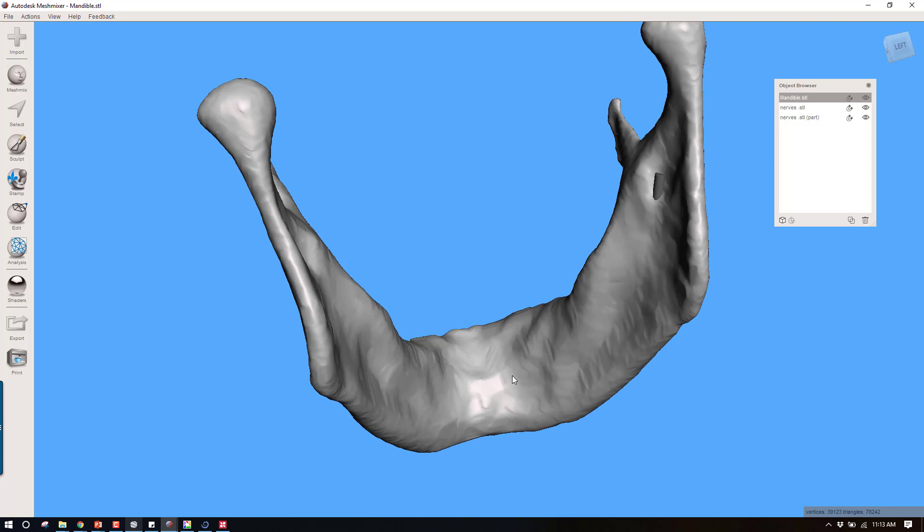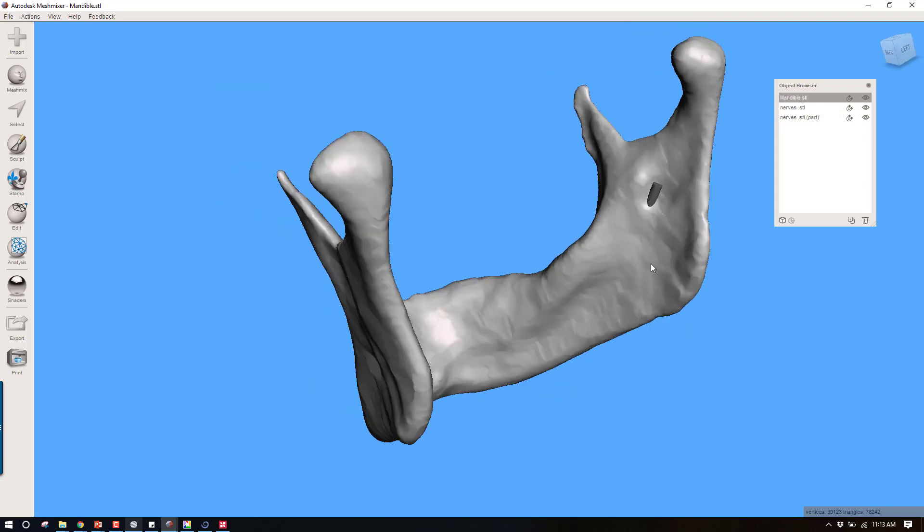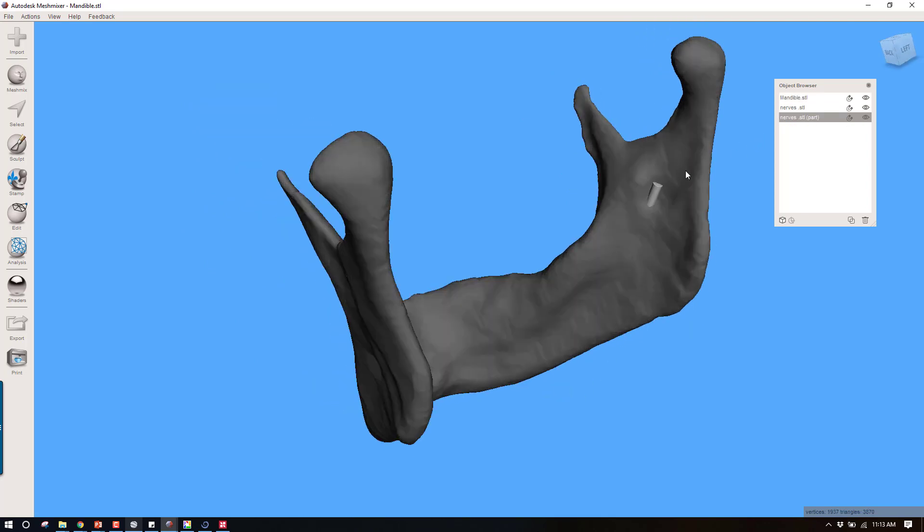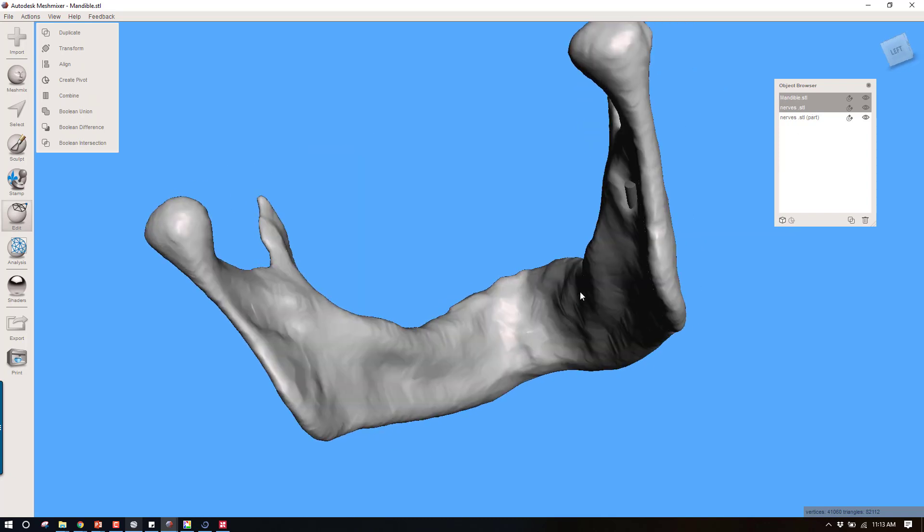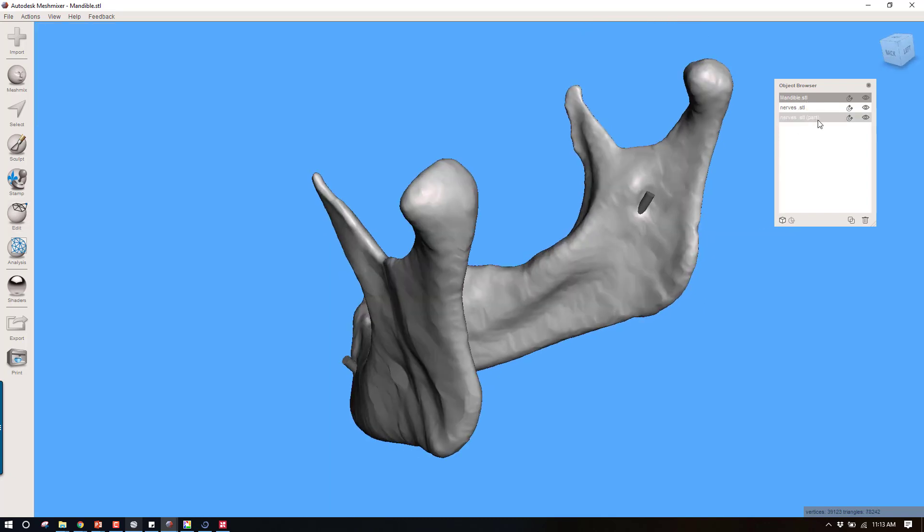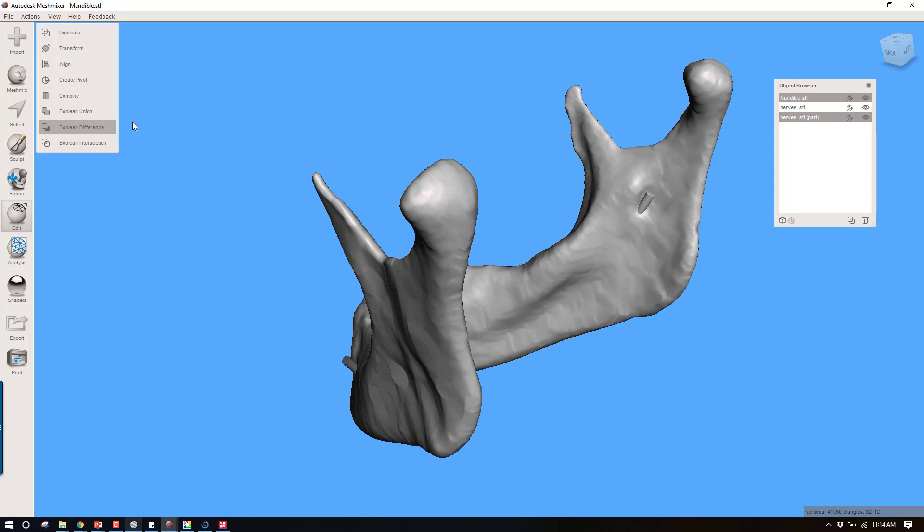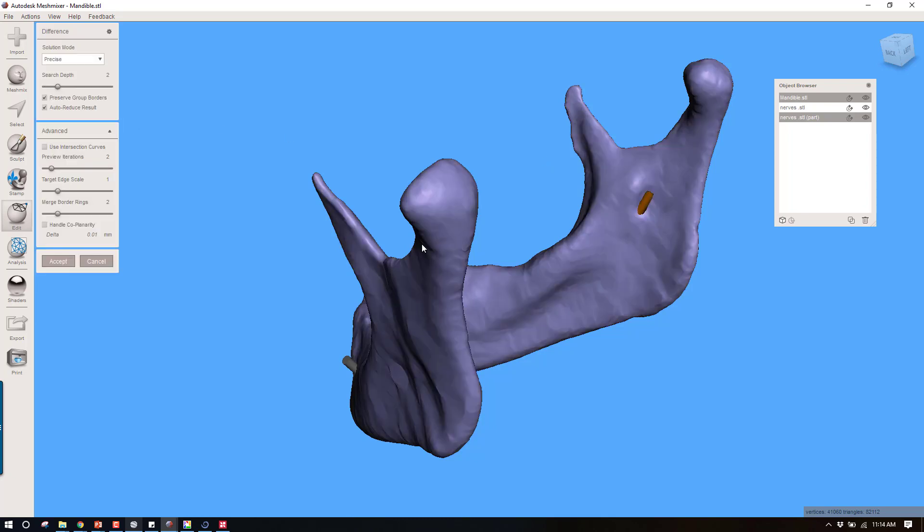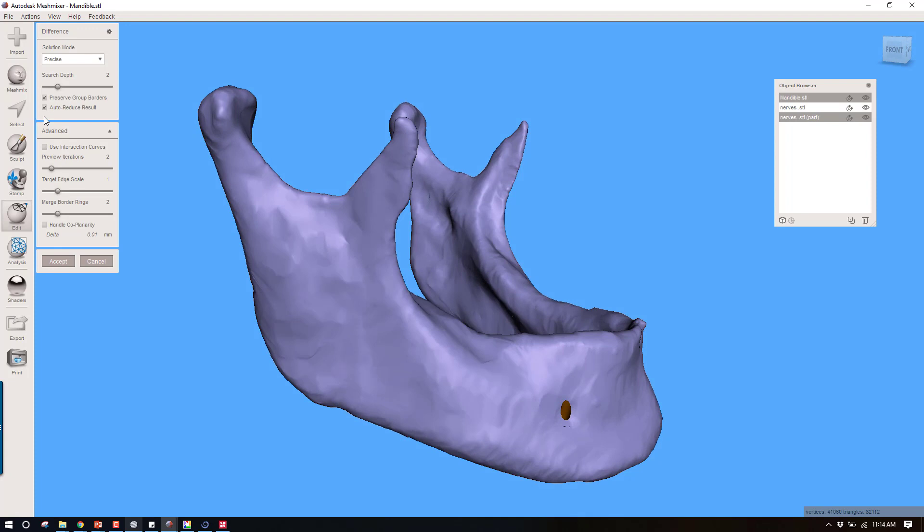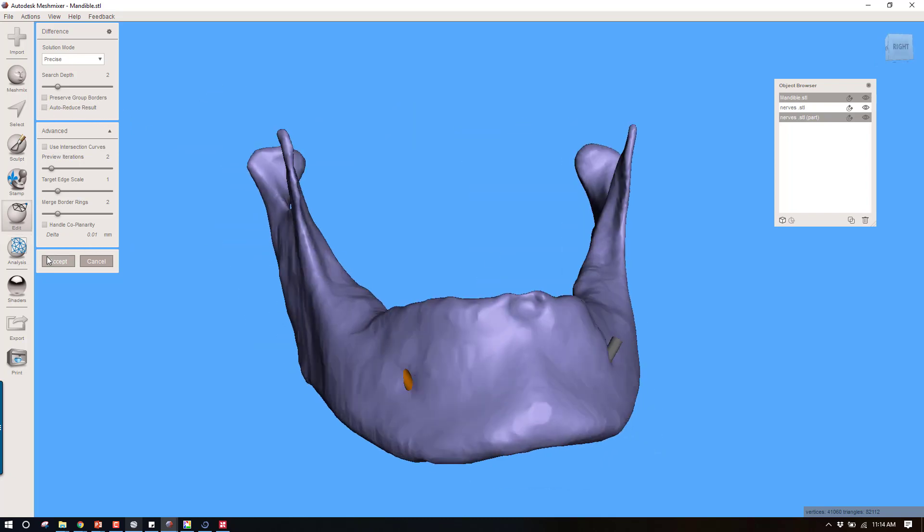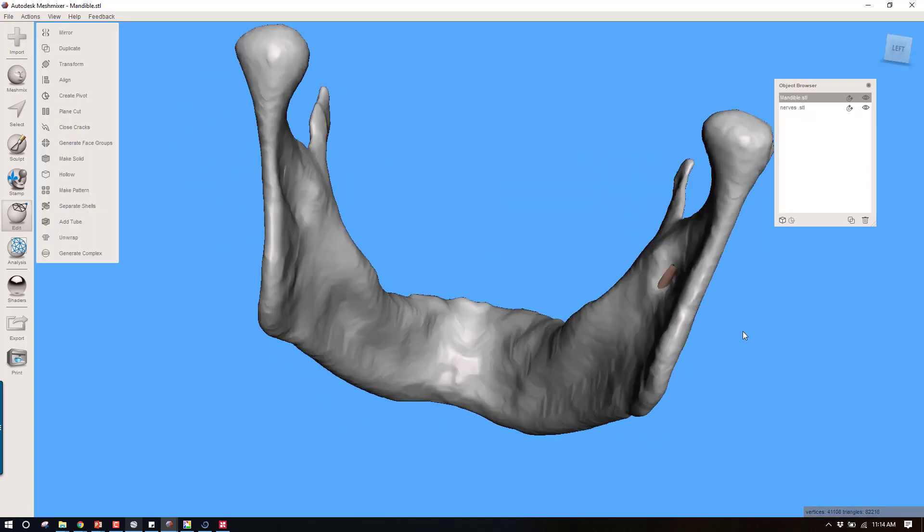Once I've done this, I can look at my model. Let's subtract this nerve first. You want to select first the object that is going to have something subtracted from it. In that case this is the mandible. Then hold down control and left click the nerve. When you control select and have done two objects, you're going to see an option for boolean difference. Click boolean difference. You need to go back and uncheck these two boxes: preserve group borders, check that off, and auto reduce result, check that off. Once you've done that, you can click OK and accept this.